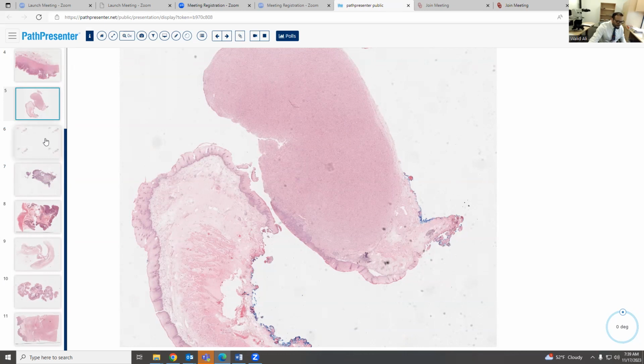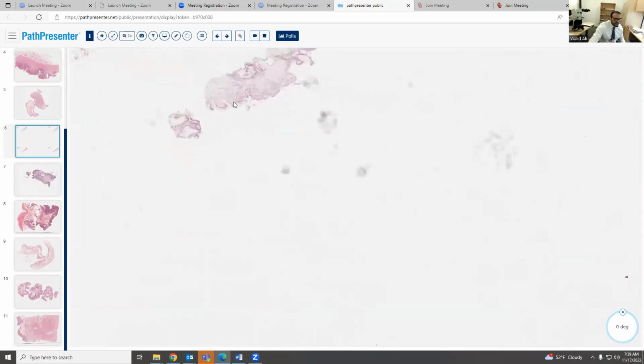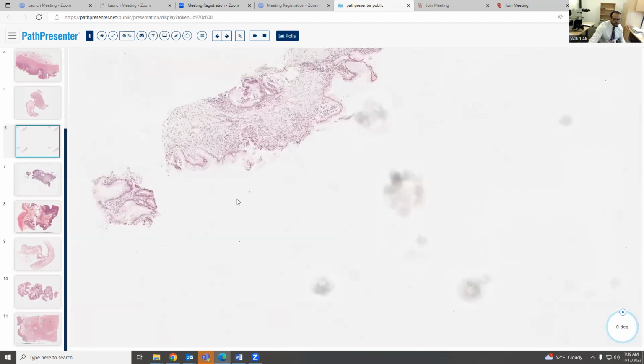Okay, let's see here. And now I brought some mesenchymal tumors also to differentiate between these two. So we now talked about GIST, and we talk now about granular cell tumor. Other things here that's also common, or it's very important to know about.